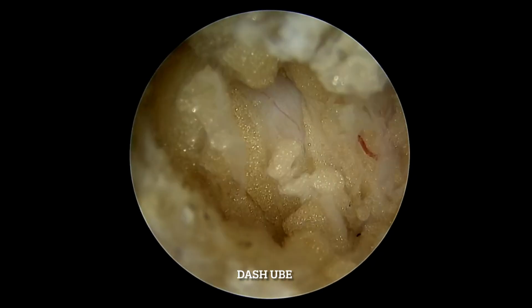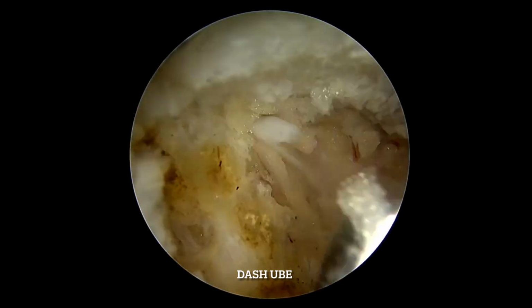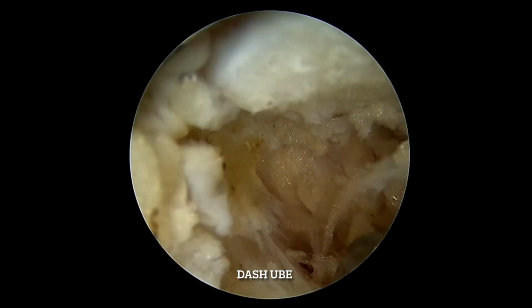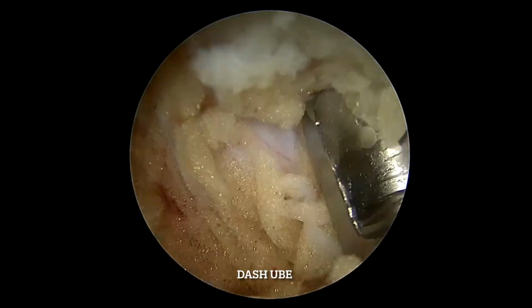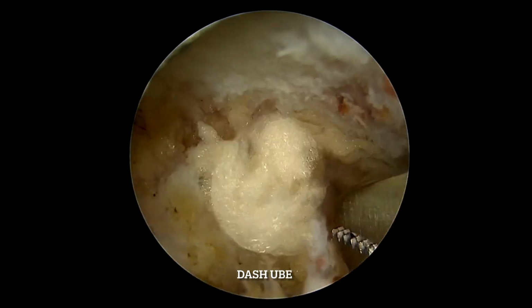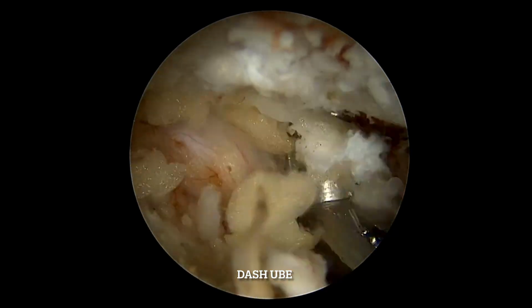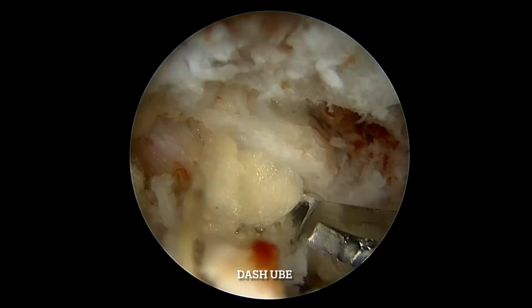Now we try to define the root. You can see a glimpse of the root. The root has to be identified. The root has a vascular supply on it, through which you can identify the root and differentiate it from a disc. The disc will have annulus fibers, whereas in the root they are absent. So you can see the root. You have to define it a little more. You can see how beautifully the root is coming out in the picture.